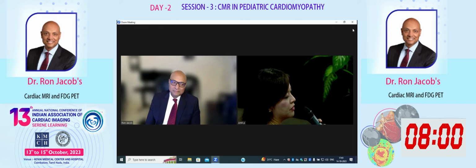And so to do that, we need some support and collaboration from the industry partners. They need to help us keep that method stable within their system, because if they change something in their sequence or the way it is programmed, we have no control over it as an academic center. So they need to partner up with us and say, right, we need to keep this method stable. If they change something, we can't do anything about that, and then the values will change.